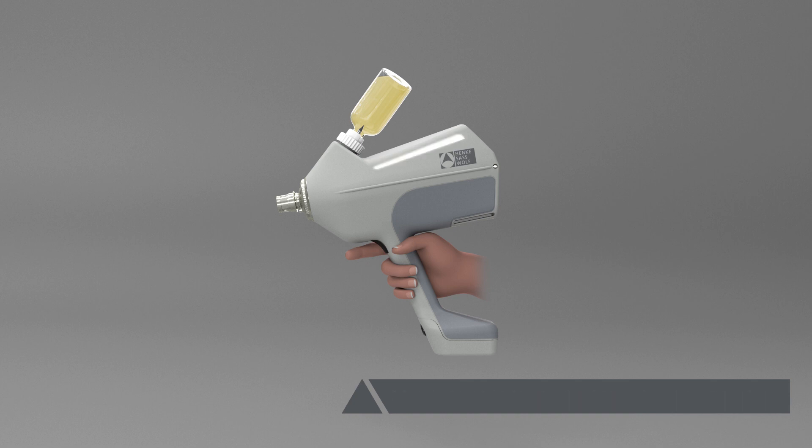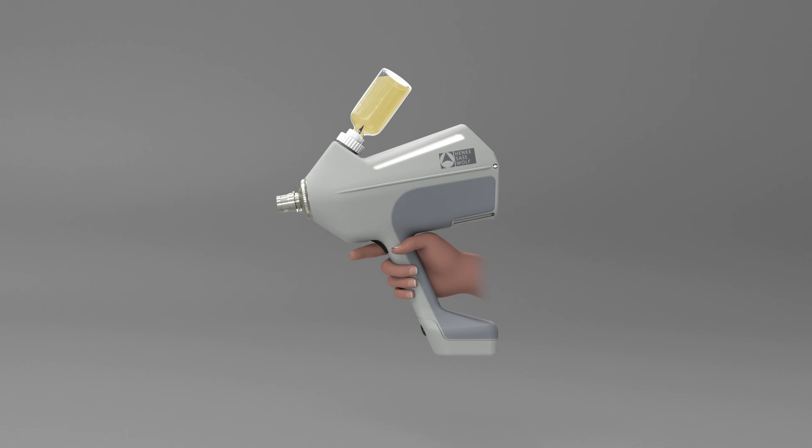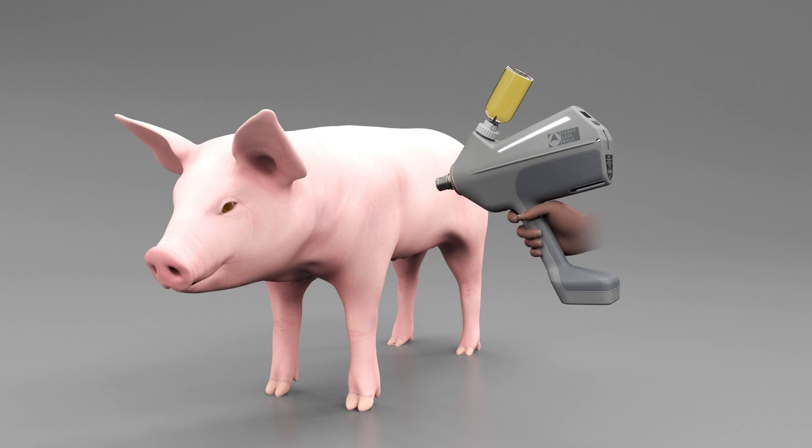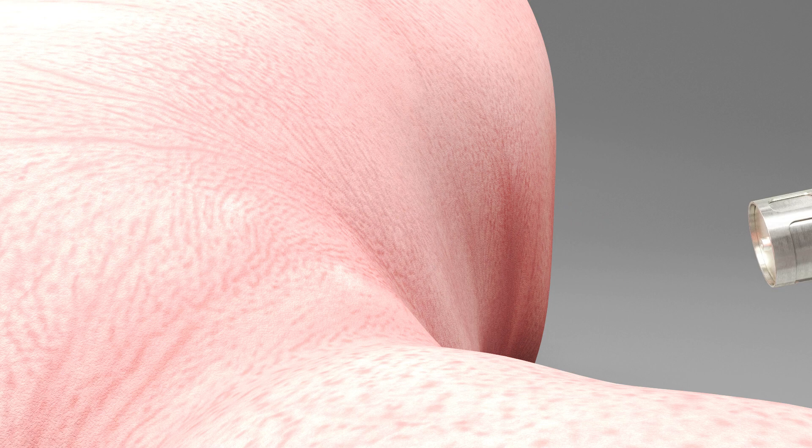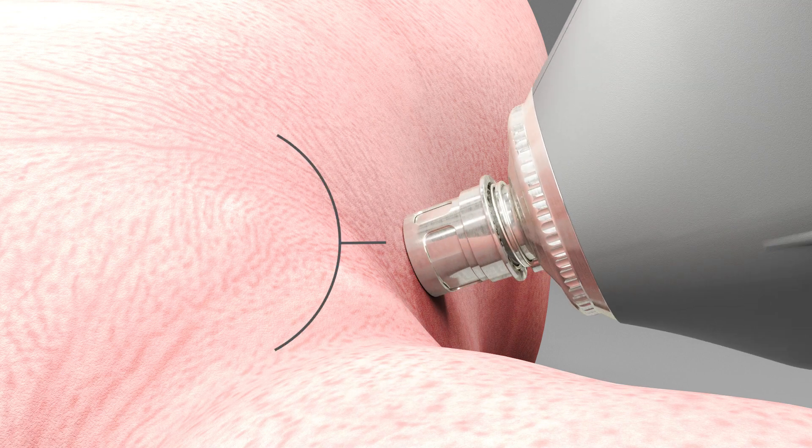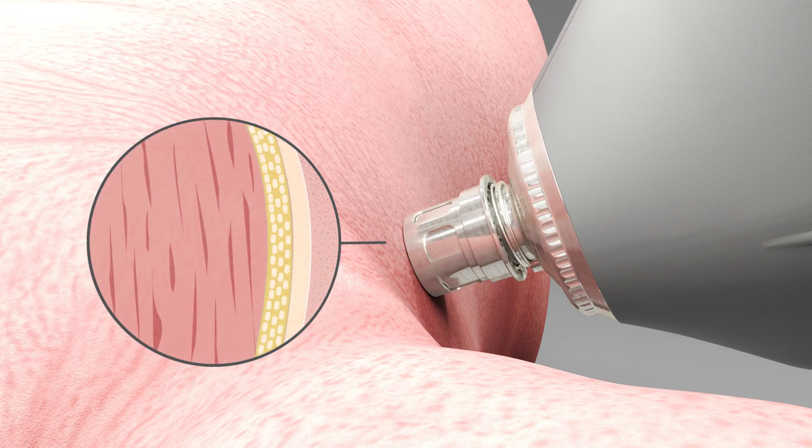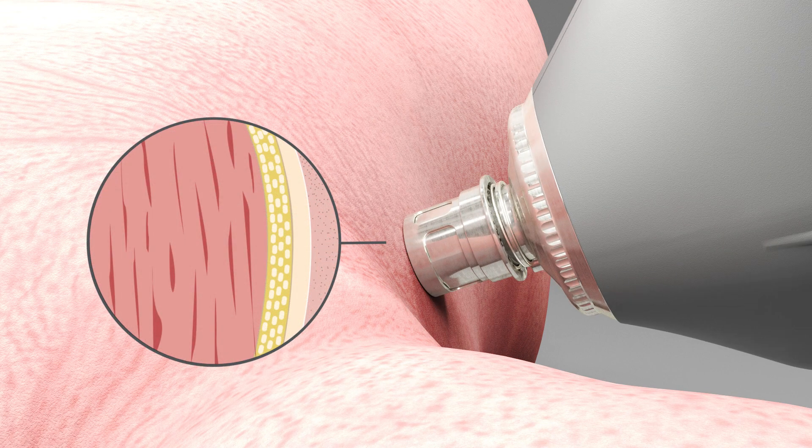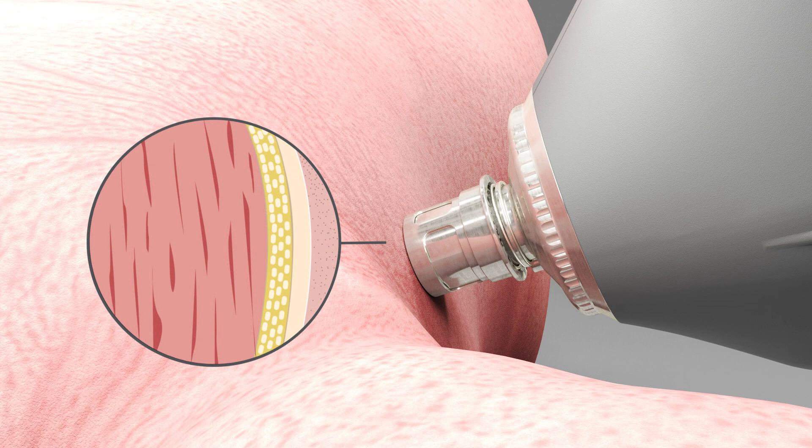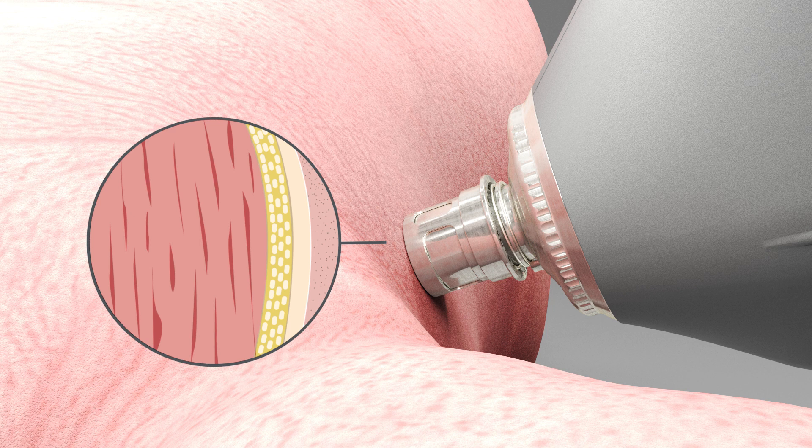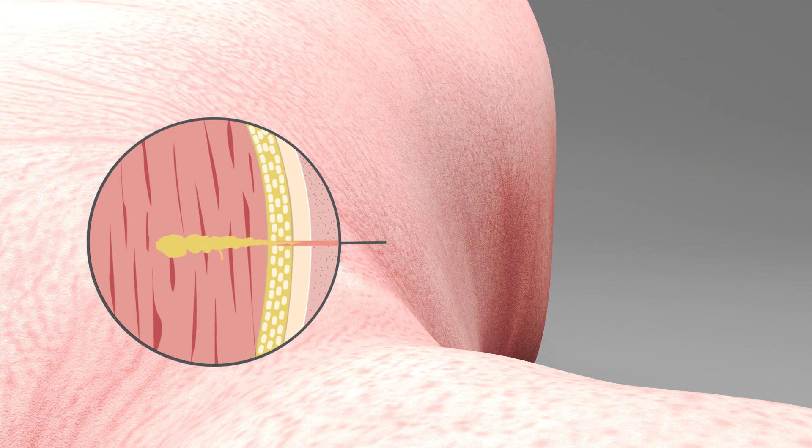To administer an injection, press and hold the trigger on the handle of the device and apply the injection head to the skin of the piglet at a 90 degree angle. An integrated sensor automatically triggers the injection as soon as sufficient pressure is applied.